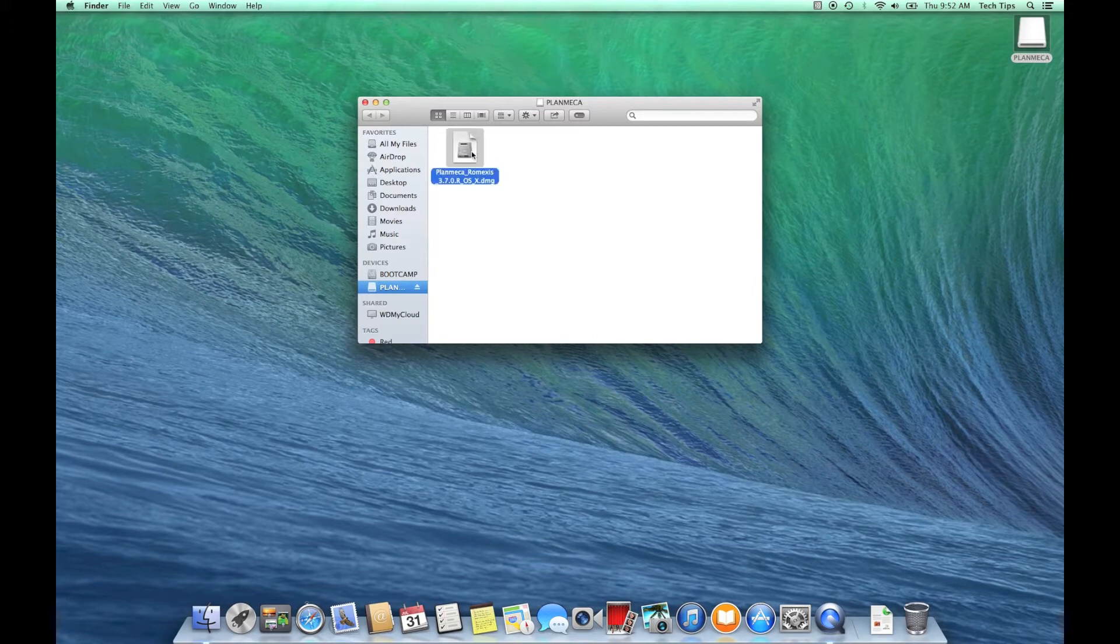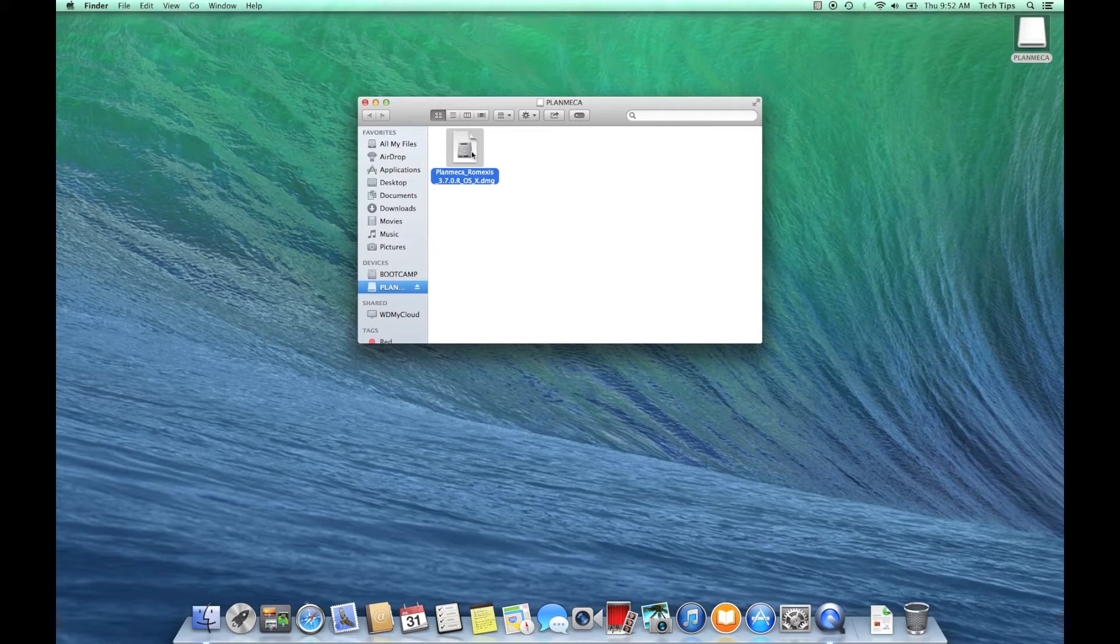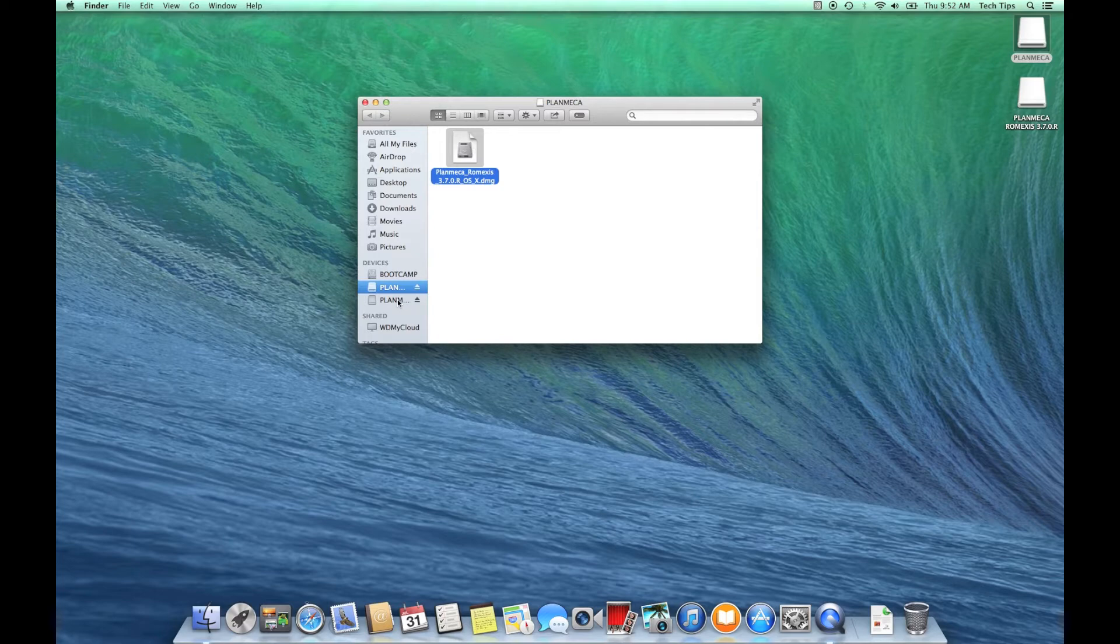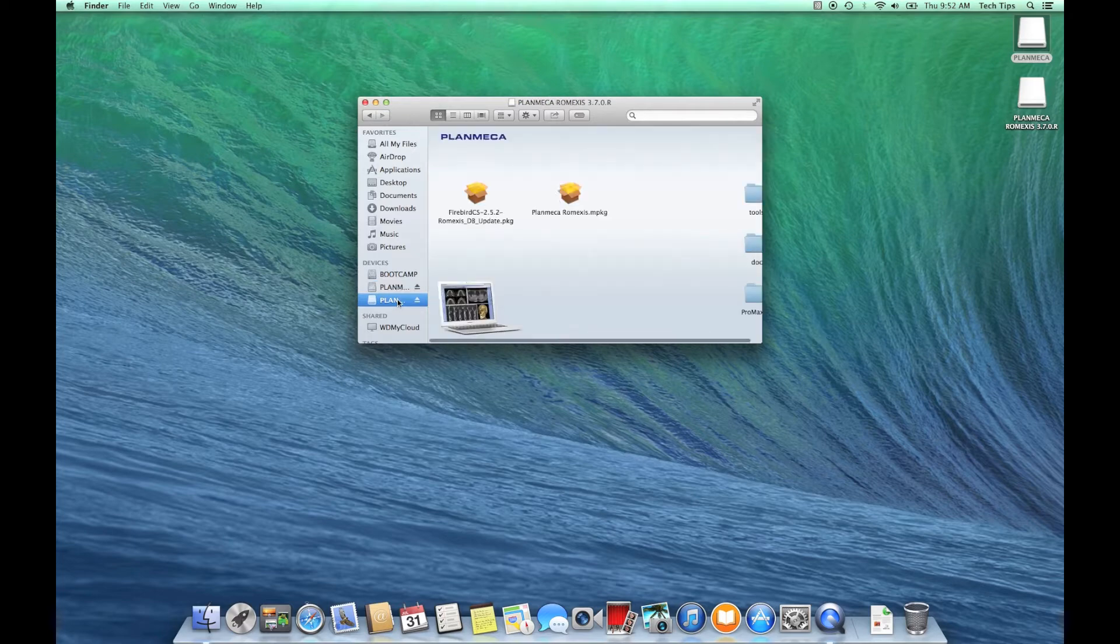going to go ahead and double click. That will open up the container that has all the components for Romexis inside of it. It should show up under your favorites list there, under devices.